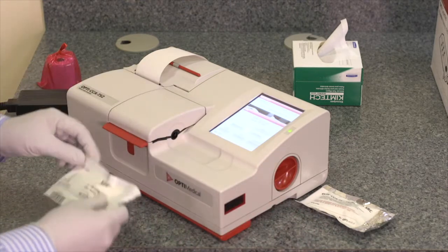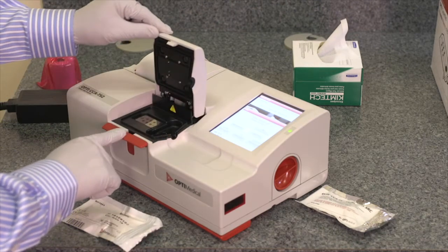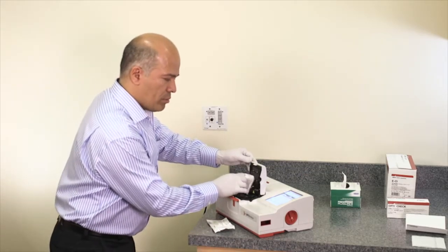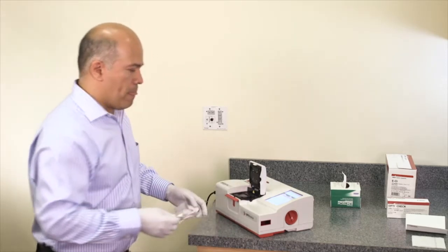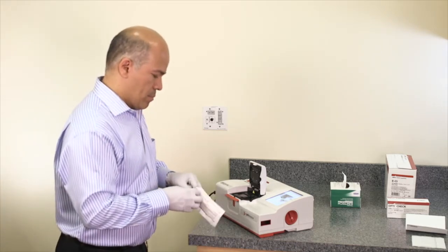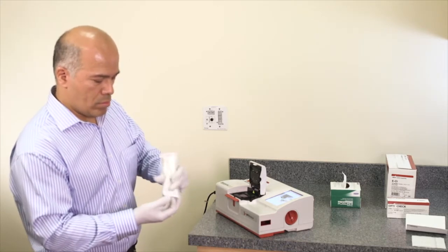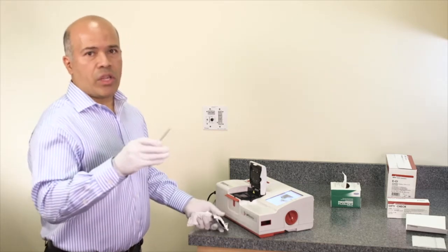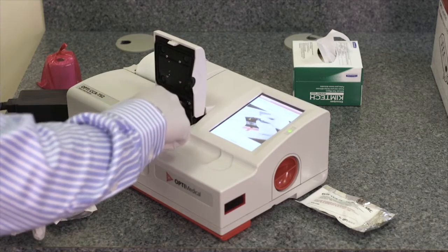The instrument then prompts to clean the optics. To clean the optics, open the cover and using a Kim Wipe, clean the top of the cover. Press OK. The analyzer then prompts the user to insert the cassette. Remove the cassette from the pouch, hold the cassette on the finger grips, insert the cassette on the chamber, and close the cover.